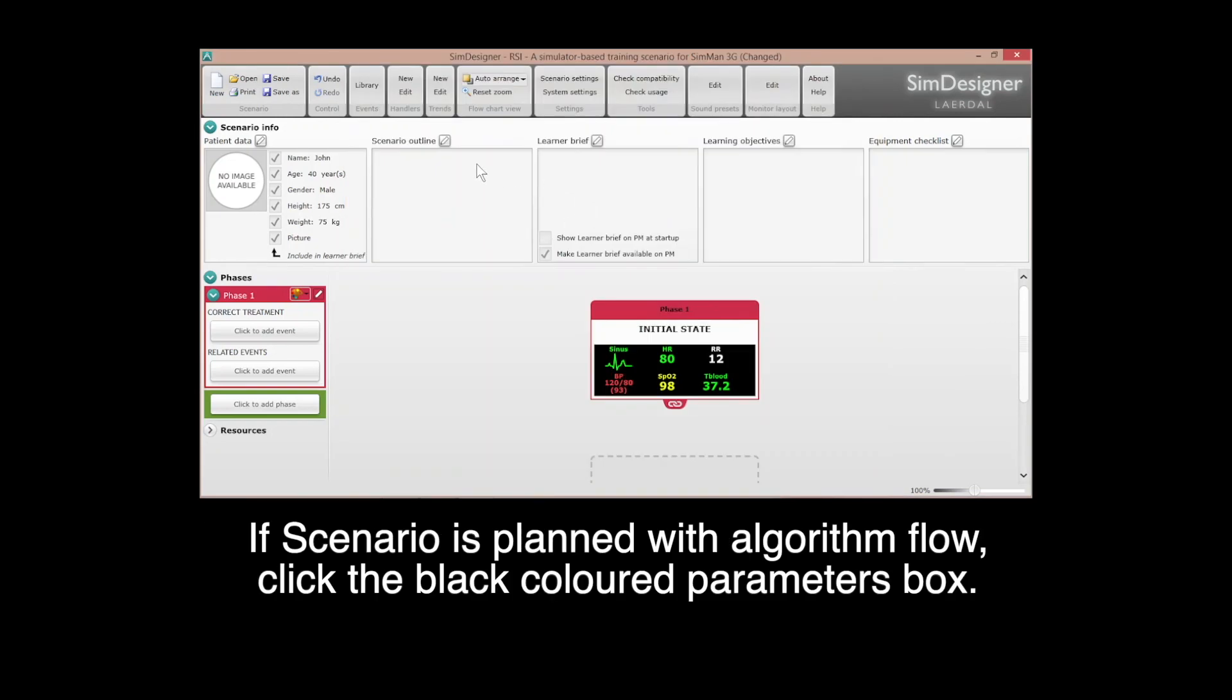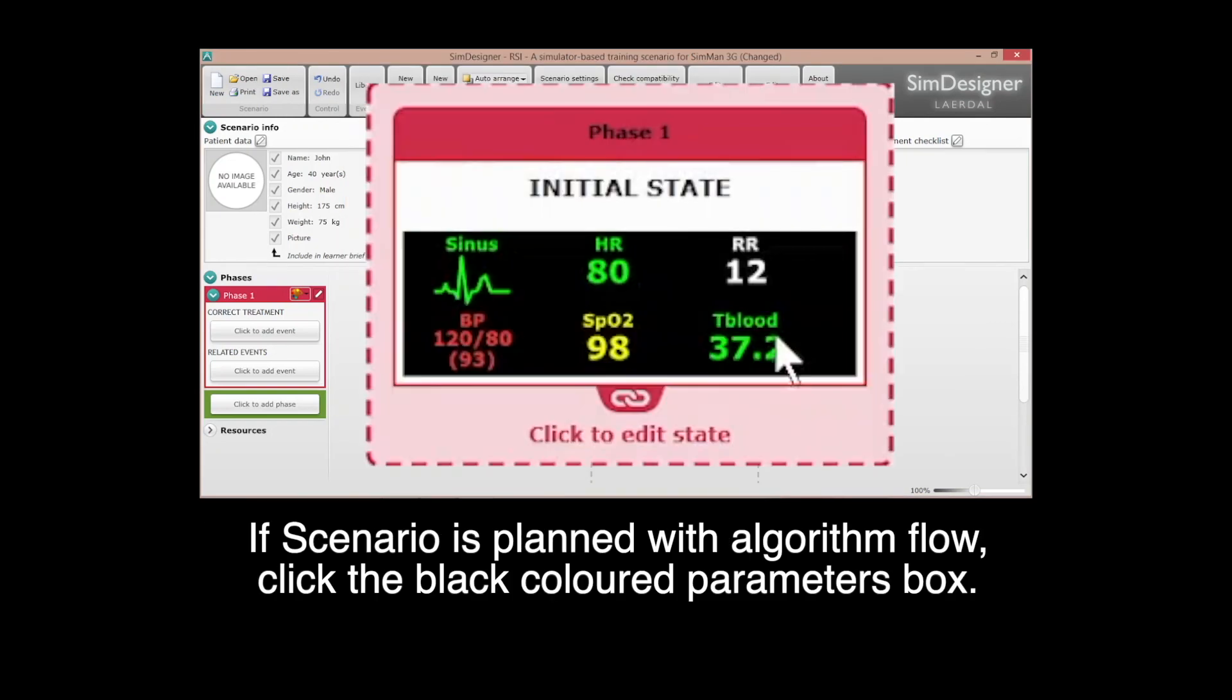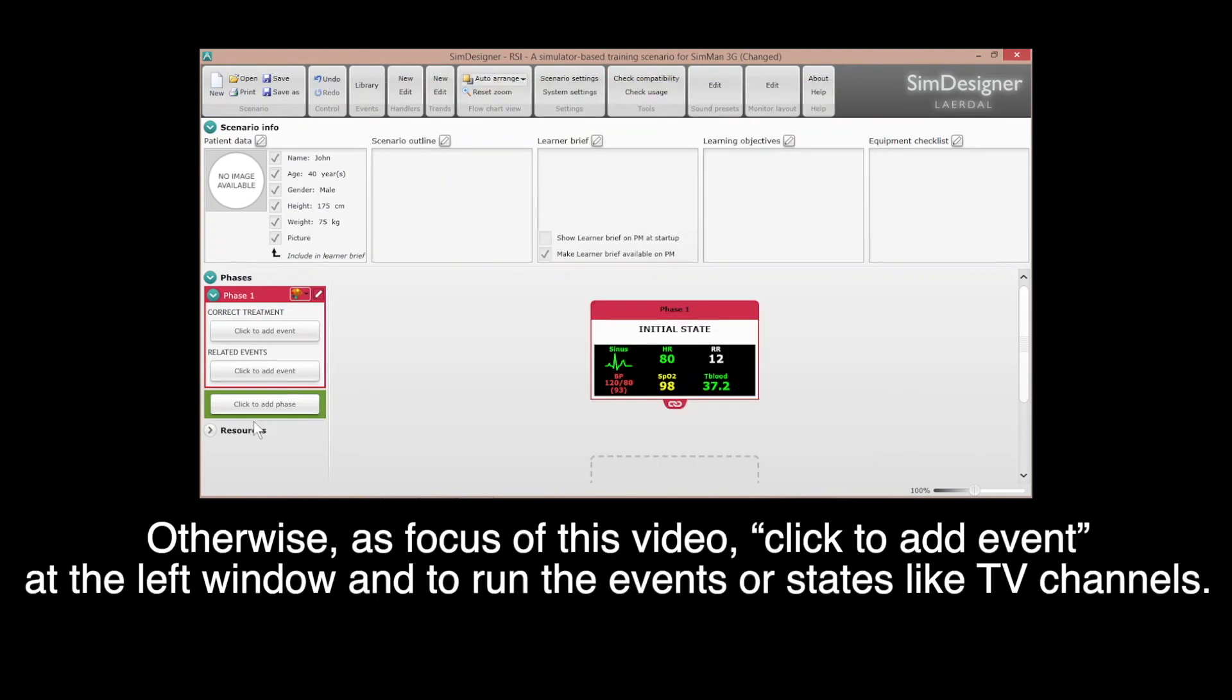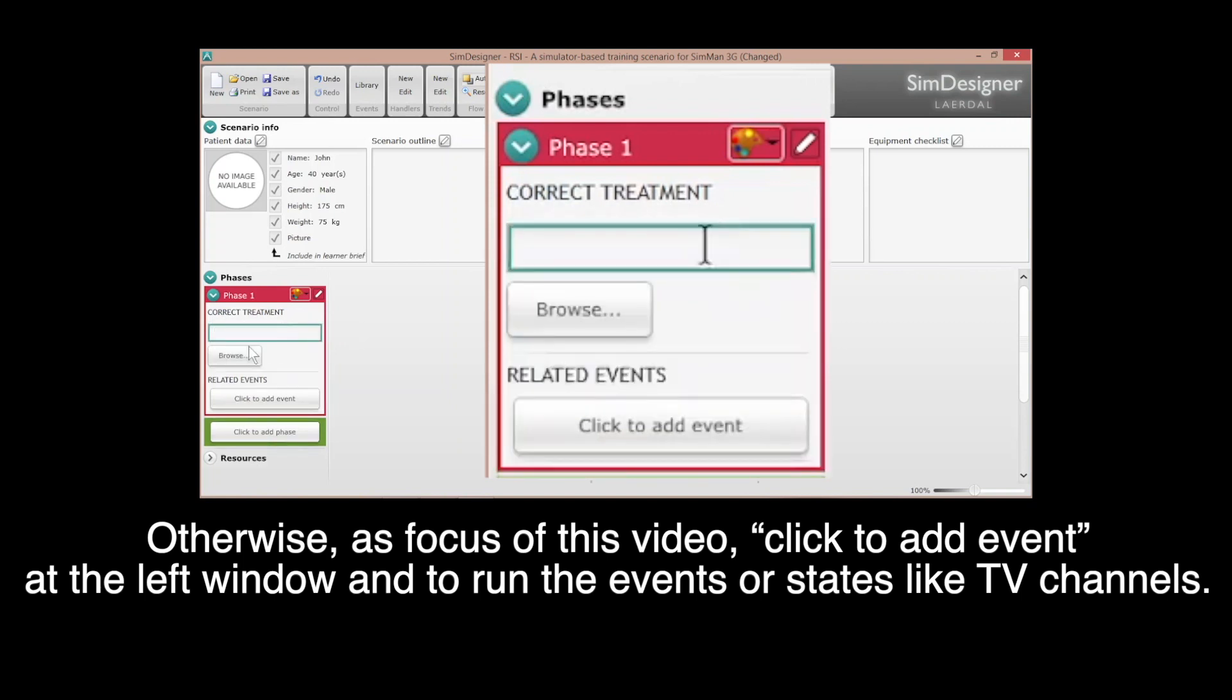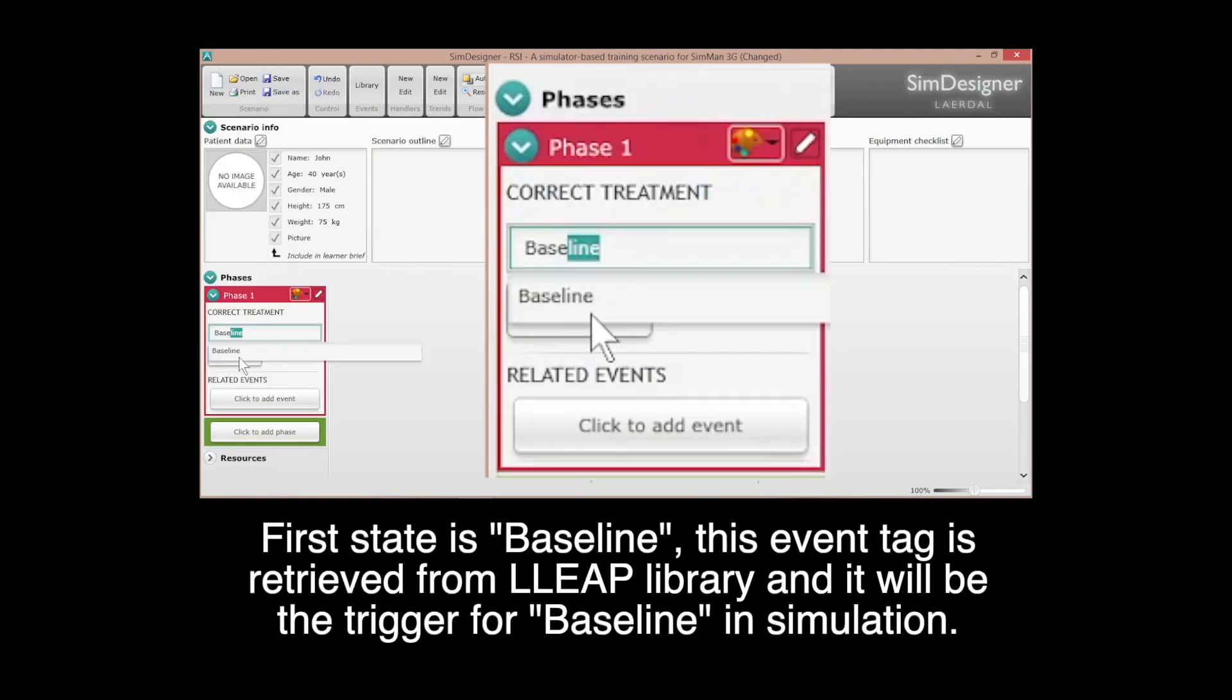This is to predetermine the patient monitor mode. If scenario is planned to execute as algorithm flow, click the black color parameter box. Otherwise, as focus of this video, click to add event at the left window and run the event and state as if TV channel. First state is baseline.